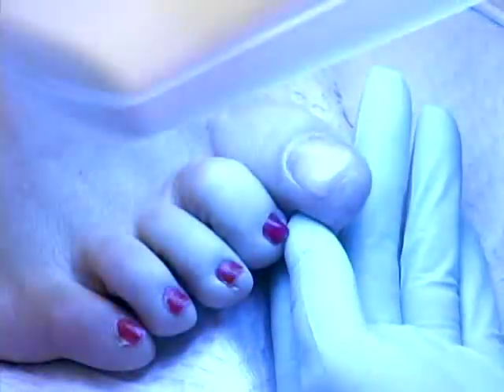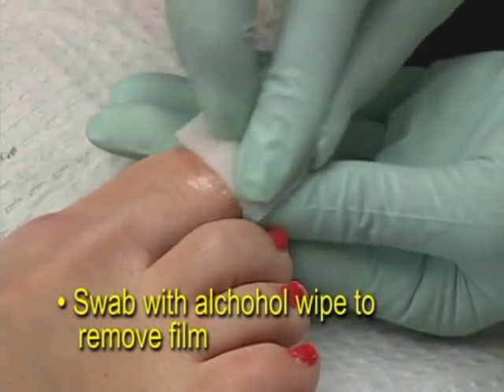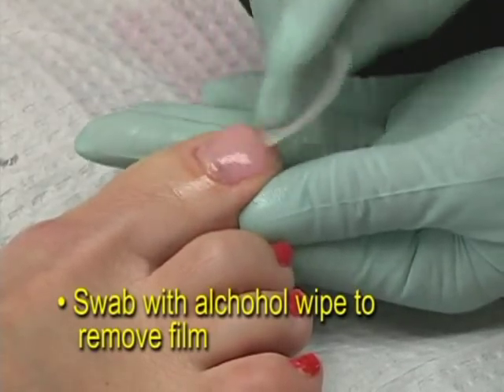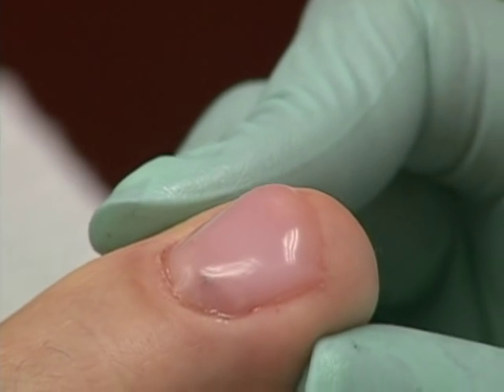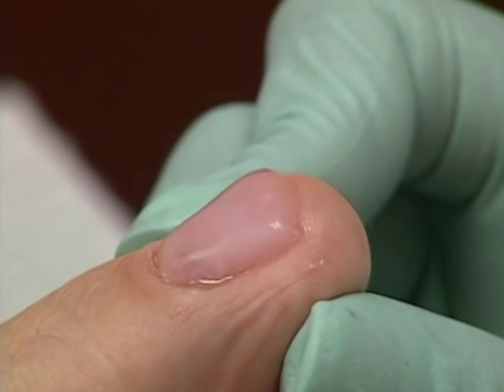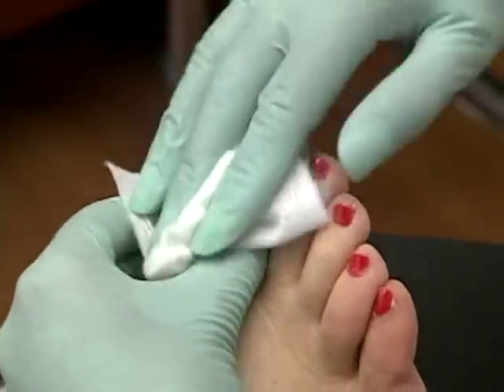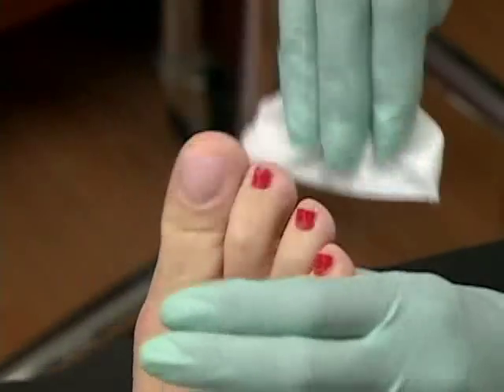After you have cured the resin with the UV light, swab the new Keriflex nail with alcohol to remove the film that forms from the reaction between the UV light and the resin. In some cases after the resin application, you may notice some bumps or ridges on the nail, which you can file down while removing any dust that may result. There is no need to reapply the resin in this case.